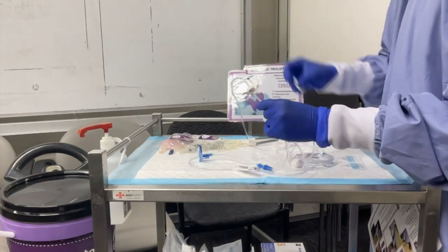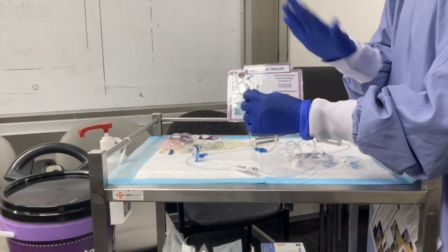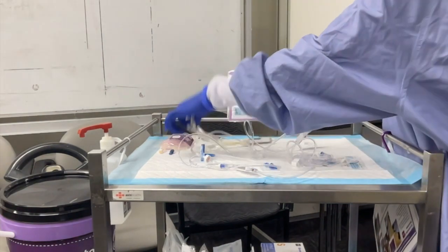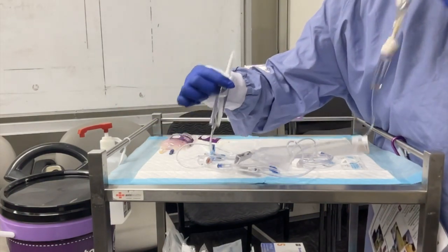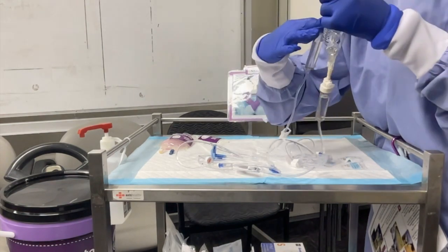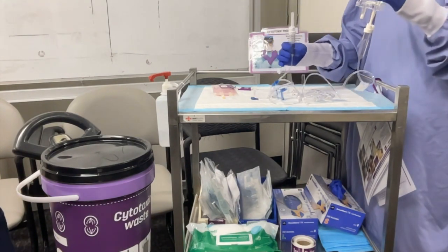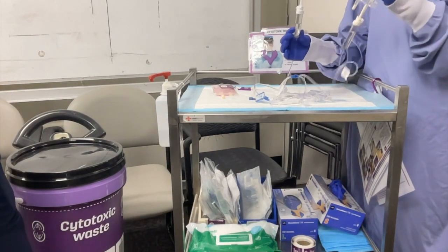Okay, so we scrub the hub for 15 seconds, and then 30 seconds dry, pretending that we've done that. And then we connect the secondary line, and let the gravity do its thing. As you can see, the chamber is now filled with the fluid maintenance. All right, so we have done the piggyback or the back priming. The chamber for the secondary line is now filled with the fluid maintenance.